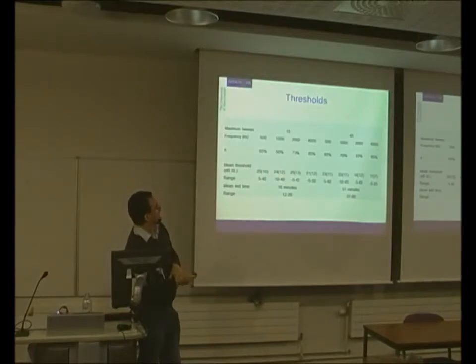So we can see how the thresholds change. For 4 kilohertz, we changed from a mean threshold of 21 to a mean of 11, and the range from -5 to 50, to 5 to 25, and that would require a change from 16 minutes on average to 51 minutes on average, ranging up to the full 20 minutes or the full 60 minutes of recording for those different times.